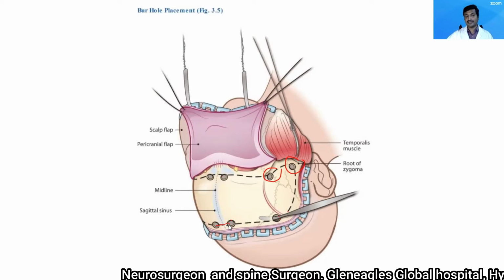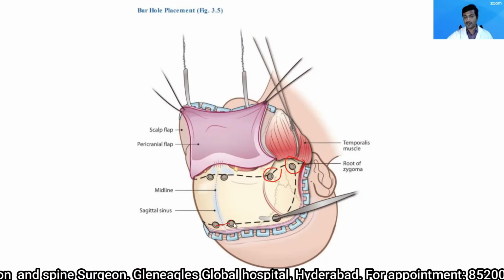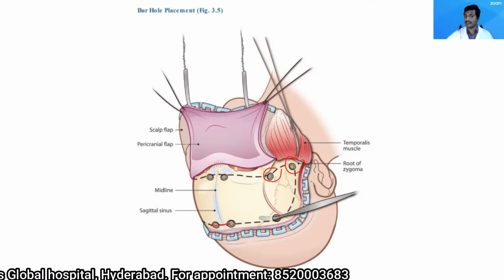So there are two techniques. Some people try to dissect it with a Penfield dissector, the way it's shown over here, gently, until from one burrhole you go into the opposite side.